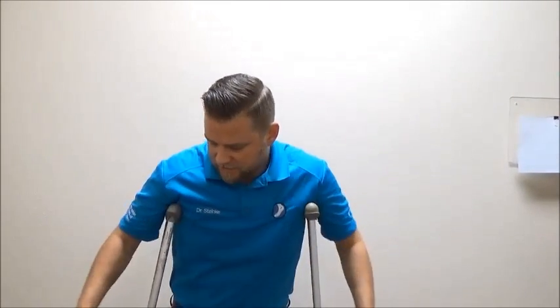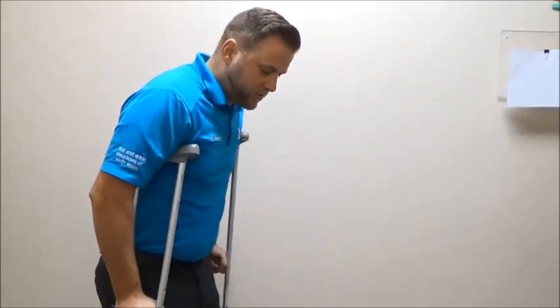When walking with crutches, remember that all of your pressure should go on your unaffected foot and on your hands — not into your armpits. We don't want you leaning way forward, because that can cause damage to the nerves in your arms or unnecessary pain. Keep pressure on the hands as you progress forward slowly.